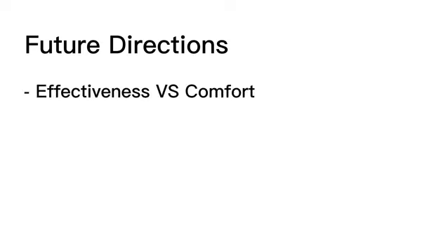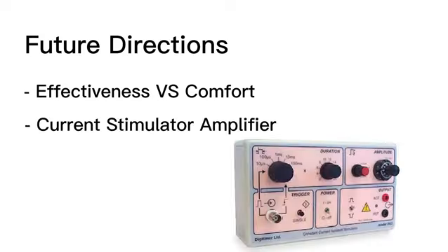In the future, this device needs a balance between effectiveness and comfort. Lower currents are more comfortable for the patient but are less effective at eliciting complete eyelid closure. Higher currents are more effective, however, but cause more pain. This issue could potentially be addressed by decreasing current but increasing frequency and pulse width. Moreover, due to the low output current drive of the myRIO, a current stimulator amplifier could be implemented in order to produce the required current.